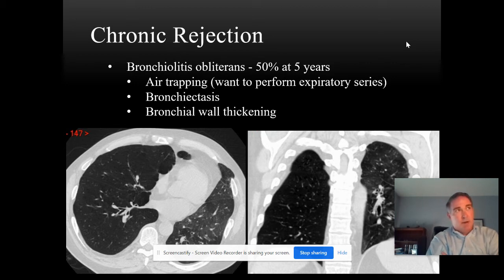either click our ILD protocol, which includes expiratory and prone imaging, or you can just do regular chest and write in the comment section, do expiratory imaging. I just click the ILD one because I figure that will get screwed up less. But again, just know the importance of that expiratory phase to see the air trapping.